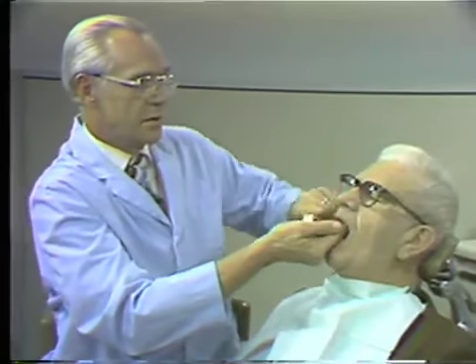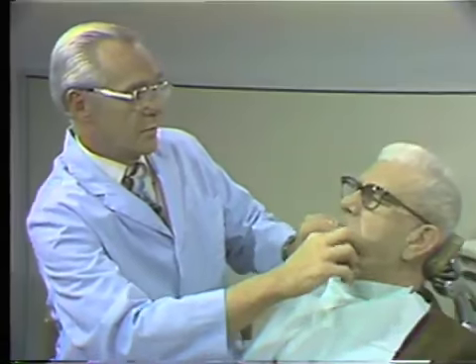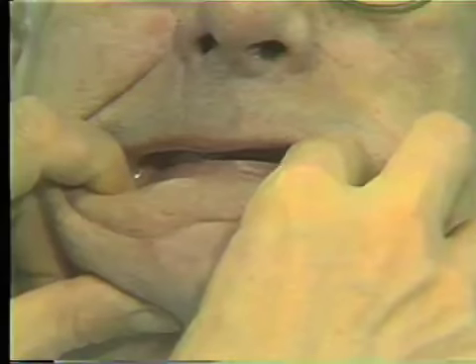And we will place now the maxillary rim in the patient, and the mandibular rim, which has been prepared by resoftening, regrooving the lower rim. Now just let us close, and you note the position of my fingers, just in centric relation, squeeze into the soft wax. A little bit more, and a little bit more, and right there. Now open, Mr. Monahan. And again, the two rims stick together.